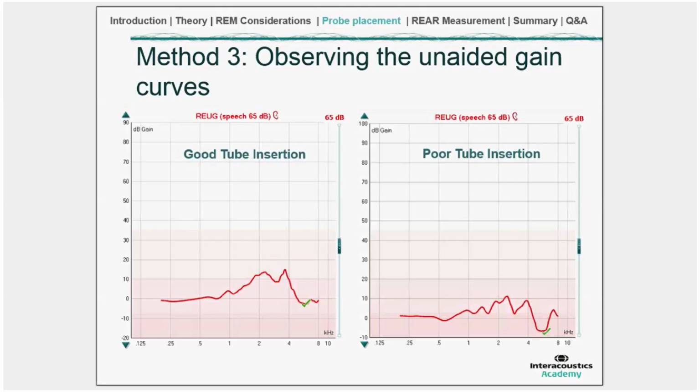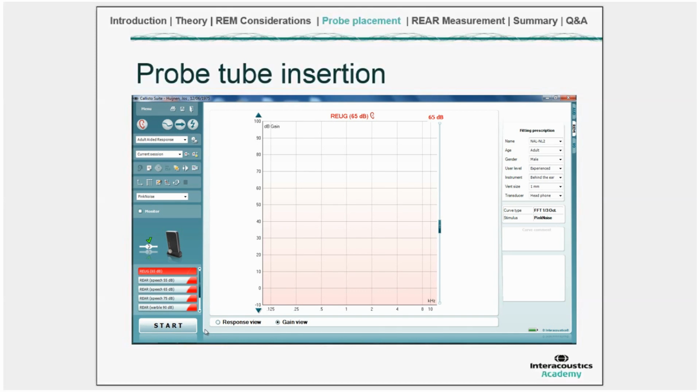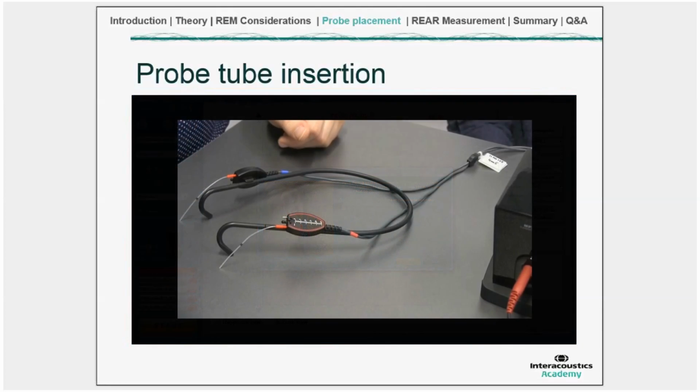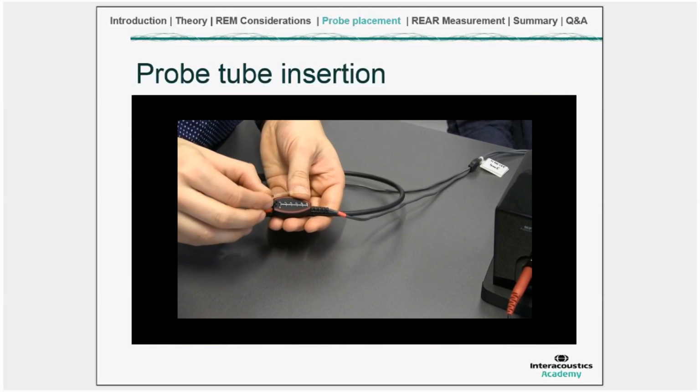So, with the probe tube in place, let's see if we can make a video demonstrating this. In the software, you press the REUG button, and then it gives you instructions. Here you can see a video of me measuring the probe tube.